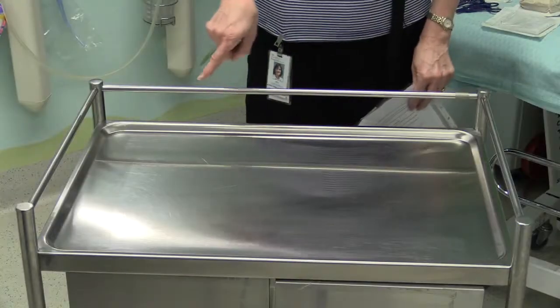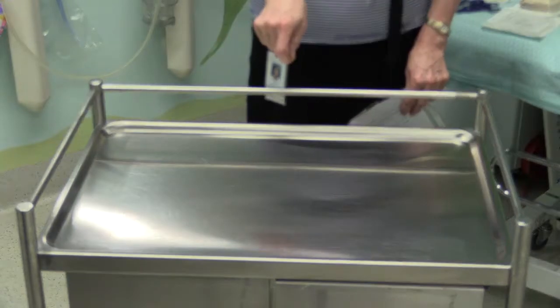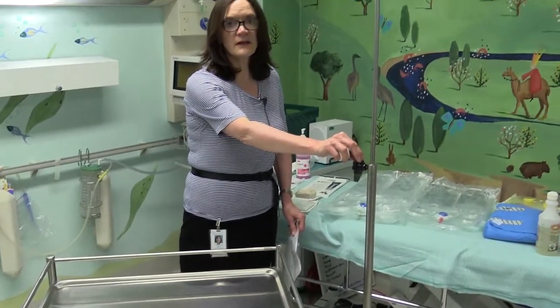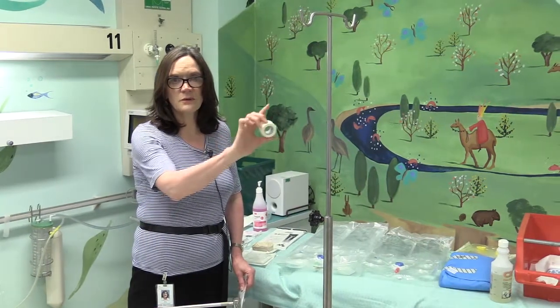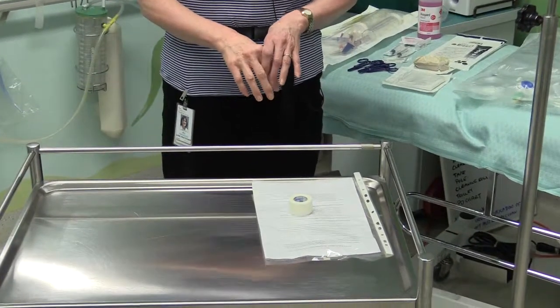We'll also need a clean trolley or a clean table, something that can be cleaned with antiseptic to set up our sterile equipment, and a pole to hang the dialysis fluid and the dialysis set, and in addition some tape, because we'll need to tape the burettes to the pole. Now I'm going to set up the equipment.